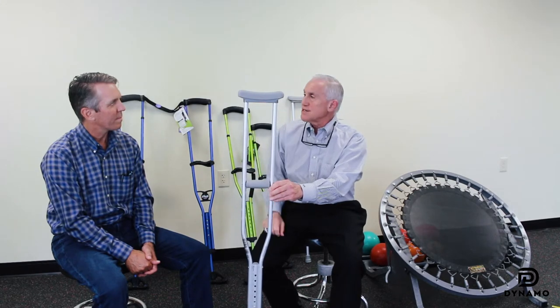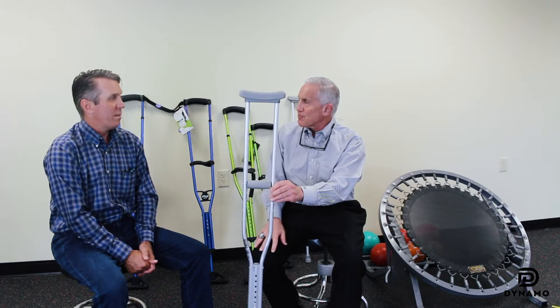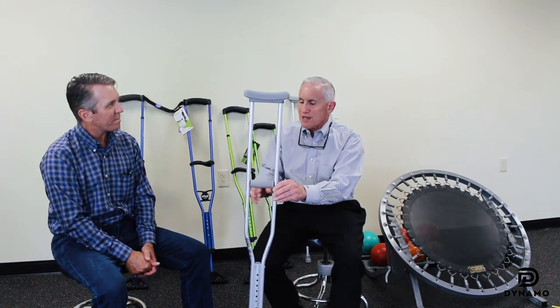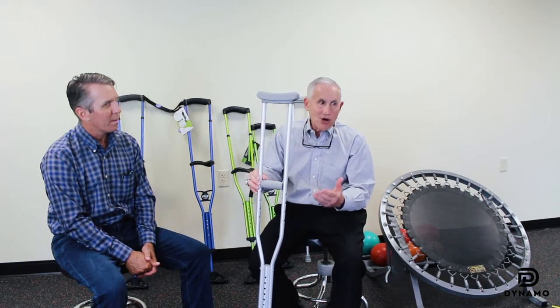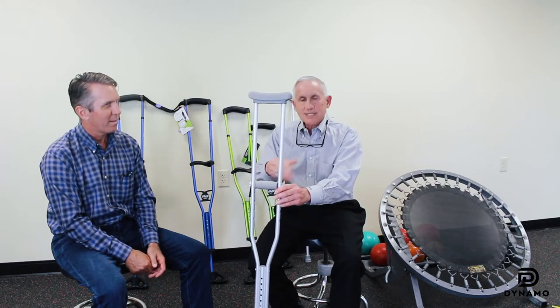And then you've got the axilla — it's 100% problematic if they lean on it, so there's no way around it. I think you have to take this traditional model and say it's been there for a long, long time, and it's time to change.